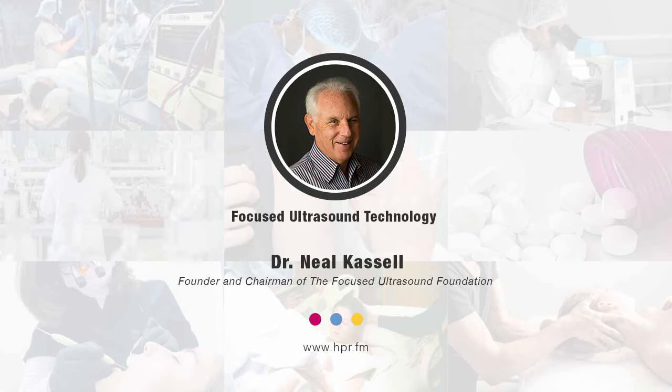Now, when you're talking about delivering drugs, are you delivering through some type of device that enters the body and then delivers ultrasound? Or are we talking about everything being done without any incisions or insertions at all? Okay, so that's a very important point. Focused ultrasound is totally non-invasive, and it's incisionless. So it minimizes all the complications that you get with radiation or the complications you get with surgery, such as infections or hemorrhage. And it's generally done on an outpatient basis, and recovery is very rapid, and the cost is less than the alternatives.